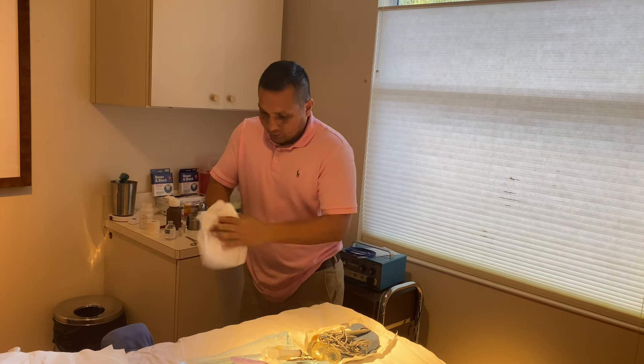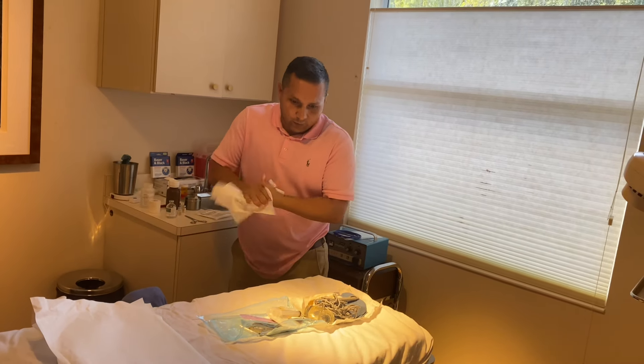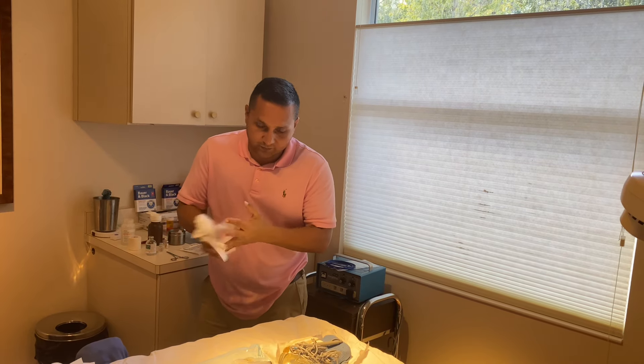My left hand will be touching the saline water and the supplements — the 2% lidocaine and the 0.5% bupivacaine. My dominant right hand will always remain sterile because I can manage everything with that one right hand. You don't need a helper for this.